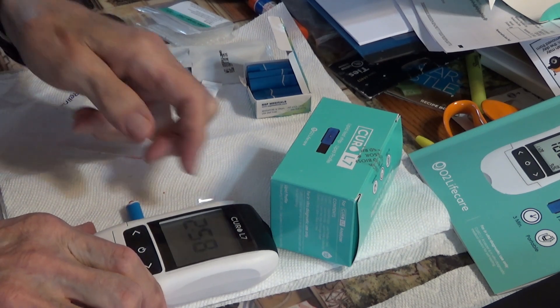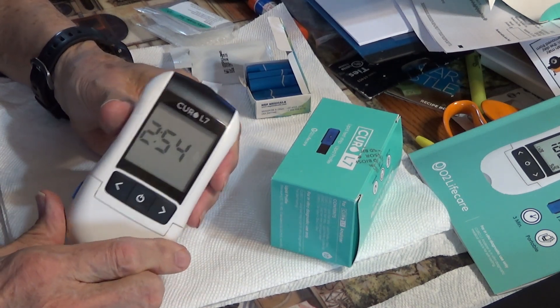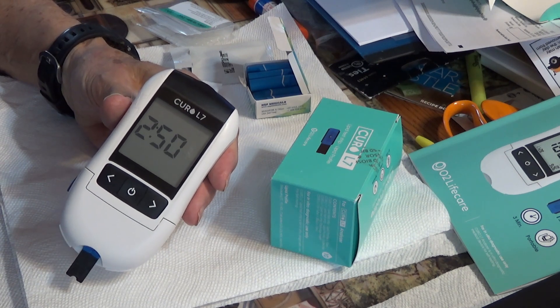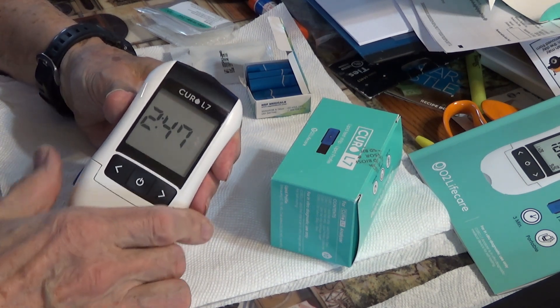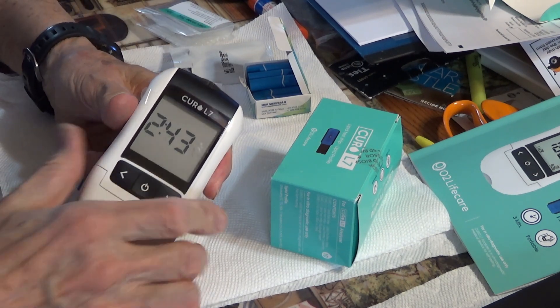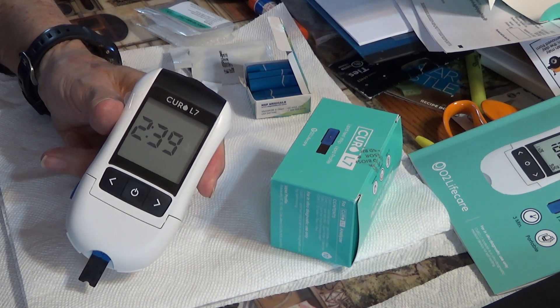And then the machine starts to count down. It counts down — takes three minutes.